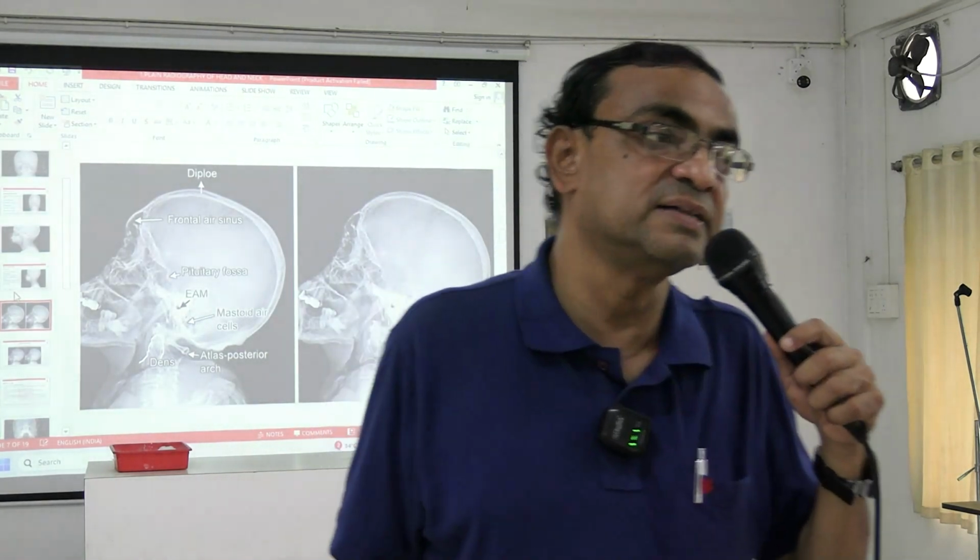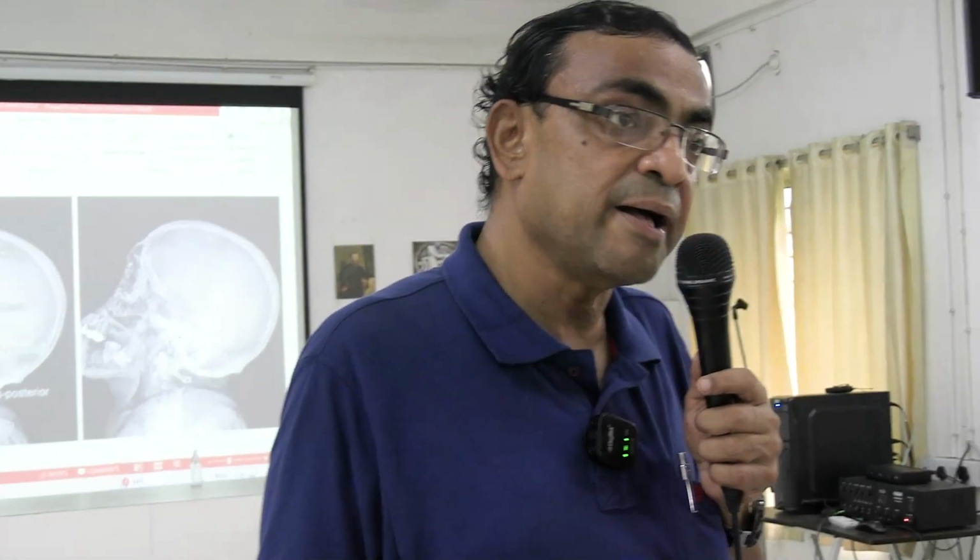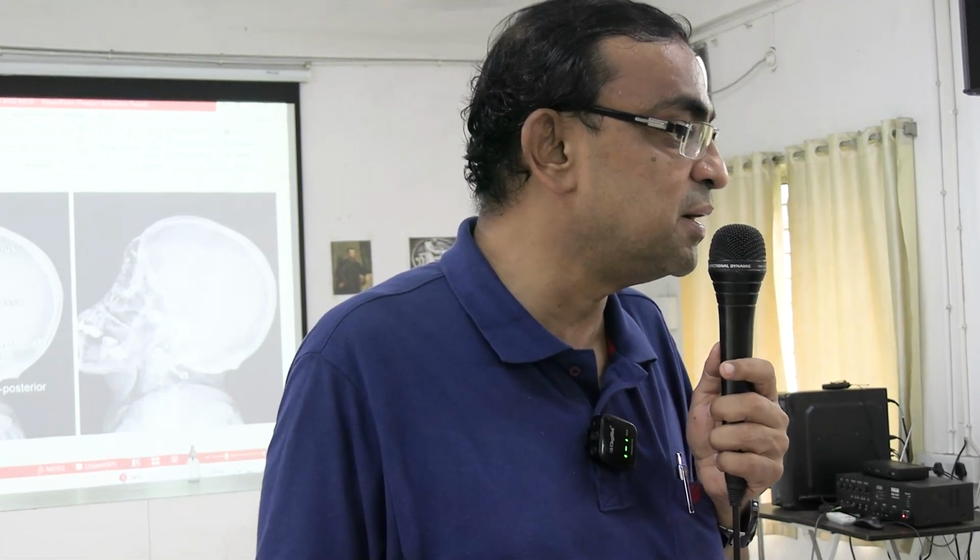So paranasal air sinus. Why are paranasal air sinuses important? They are the air conditioning chambers.